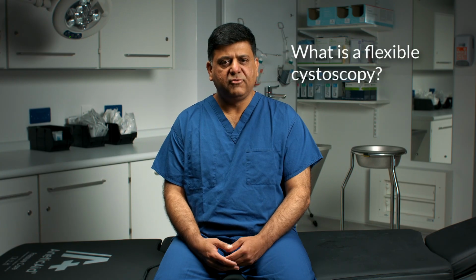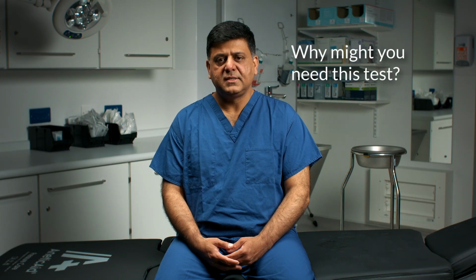So, what is a flexible cystoscopy? This is a test to look inside your bladder and water pipe and diagnose the cause behind unusual urinary symptoms. Why might you need this test? A cystoscopy is a highly effective way of investigating a broad range of bladder problems such as blood in your pee, recurrent UTIs, pelvic pain, and troublesome urinary symptoms.